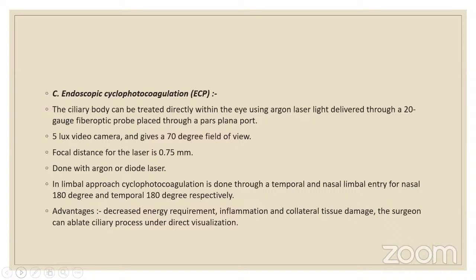In the limbal approach, cyclophotocoagulation is done through a temporal and nasal limbal entry for nasal 180 and temporal 180 degrees. The advantages are decreased energy requirement, inflammation, and collateral tissue damage, and the surgeon is able to see the ciliary process under direct visualization.